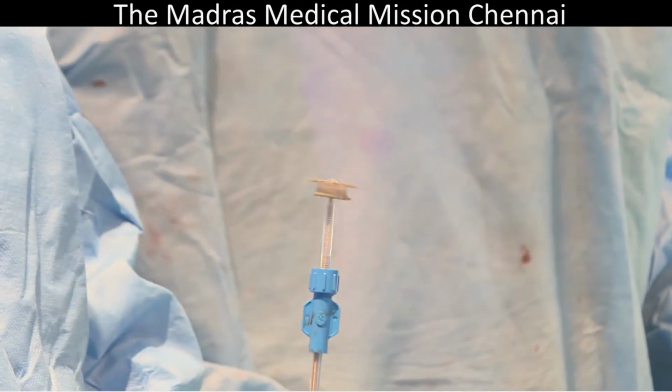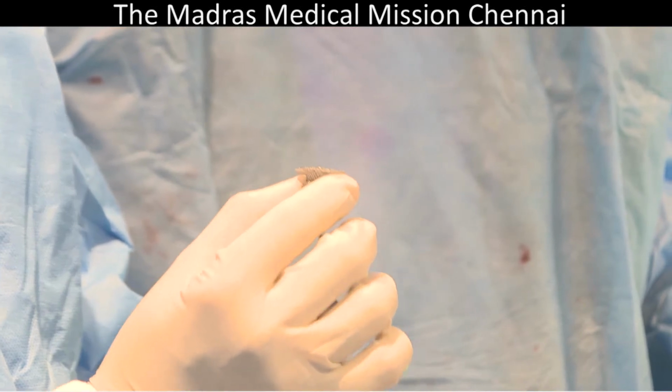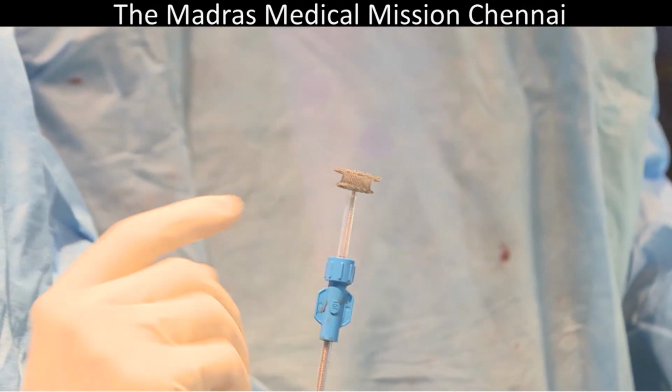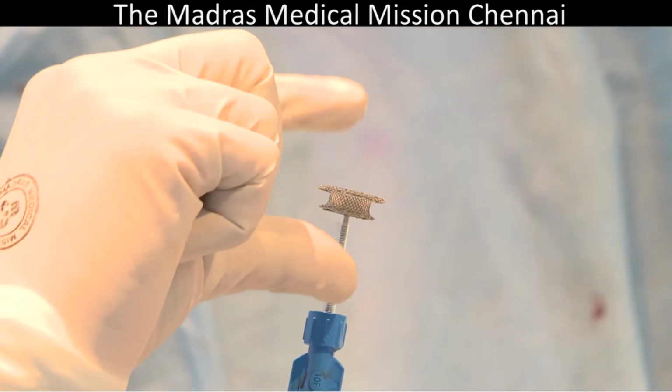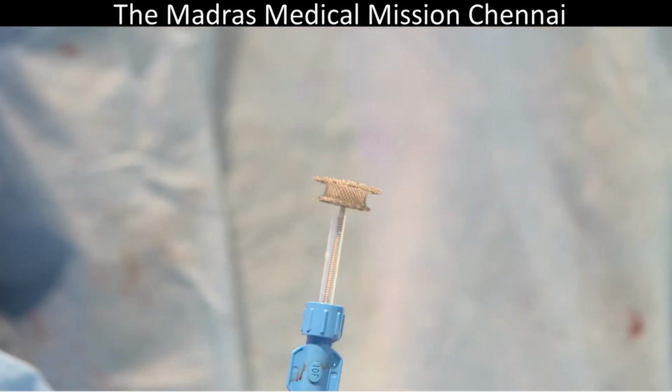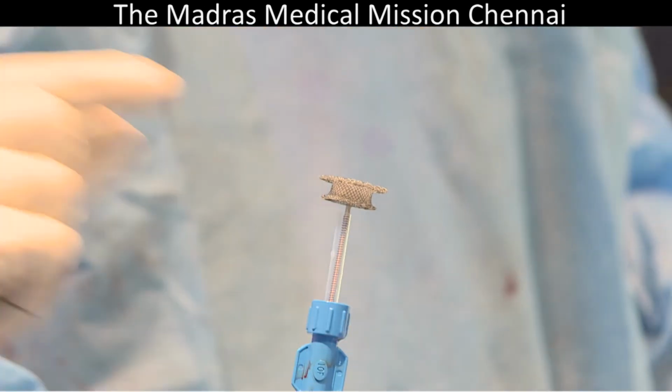Since it is a window, I want to be secure, so we have a retention skirt on the pulmonary artery, and there is a 7 millimeter separation between the two to accommodate the thickness of the ascending aorta and the thickness of the pulmonary artery.